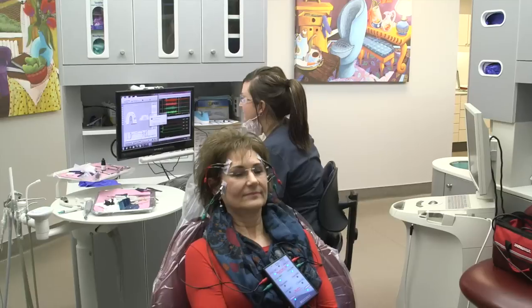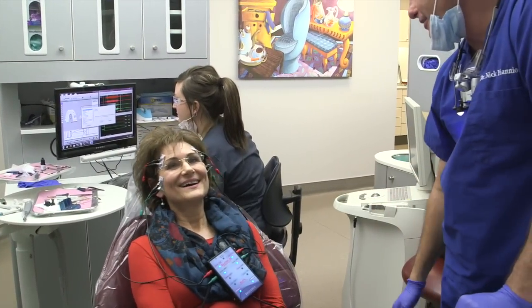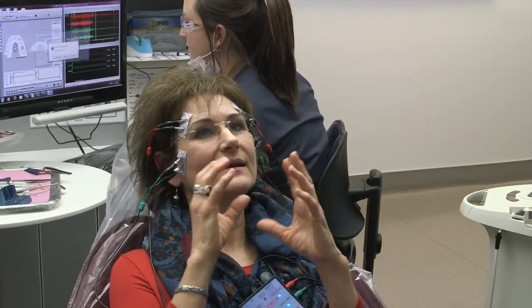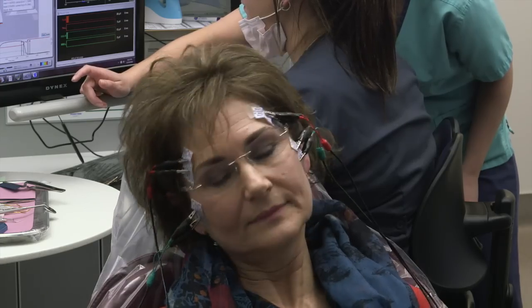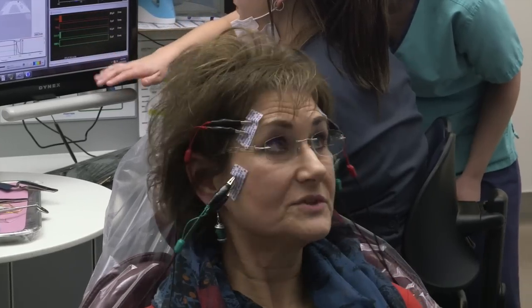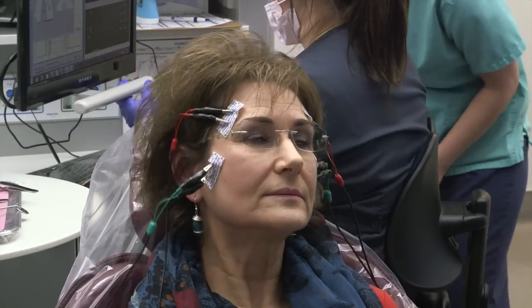It takes you 0.22 seconds on the right side. You're done. In your own words — glad you had it done? Yes, definitely. What's it feel like? It felt a little weird at first, but it's like adjusting. A little bit flushed and hard to describe — much more relaxed. It feels relaxed in here, and probably the neck too. Shoulders still tight but a little different. Now go get an adjustment from the chiropractor and it might actually last.